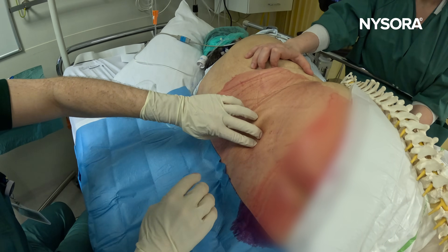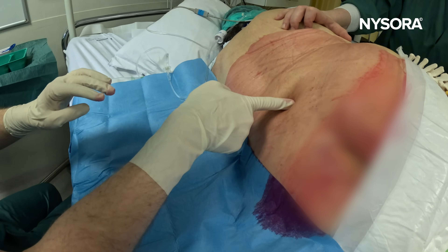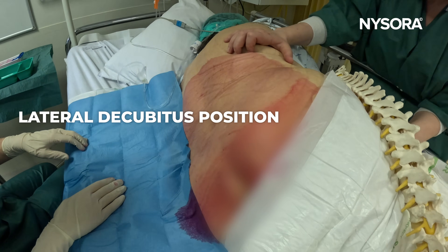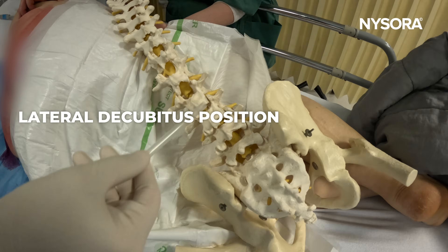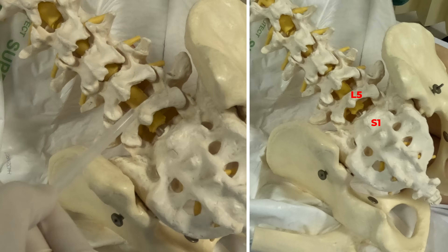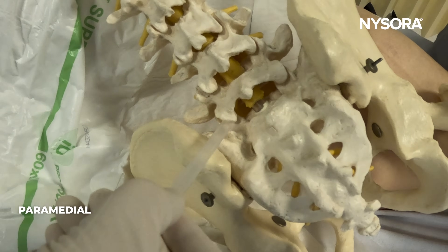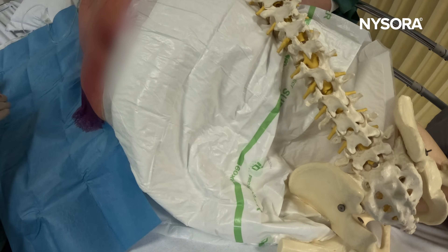You're going to do a paramedial approach to spinal anesthesia — this is certainly not an easy back, which is why we want to first review the anatomy with one of our trainees. The patient is in this position; what we want to find is the iliac crest. We're going to go slightly caudad, aiming for either L5-S1 or L4-L5 space paramedially. Once we hit bone, if we do, we walk off the bone, redirect, and walk into the subarachnoid space.